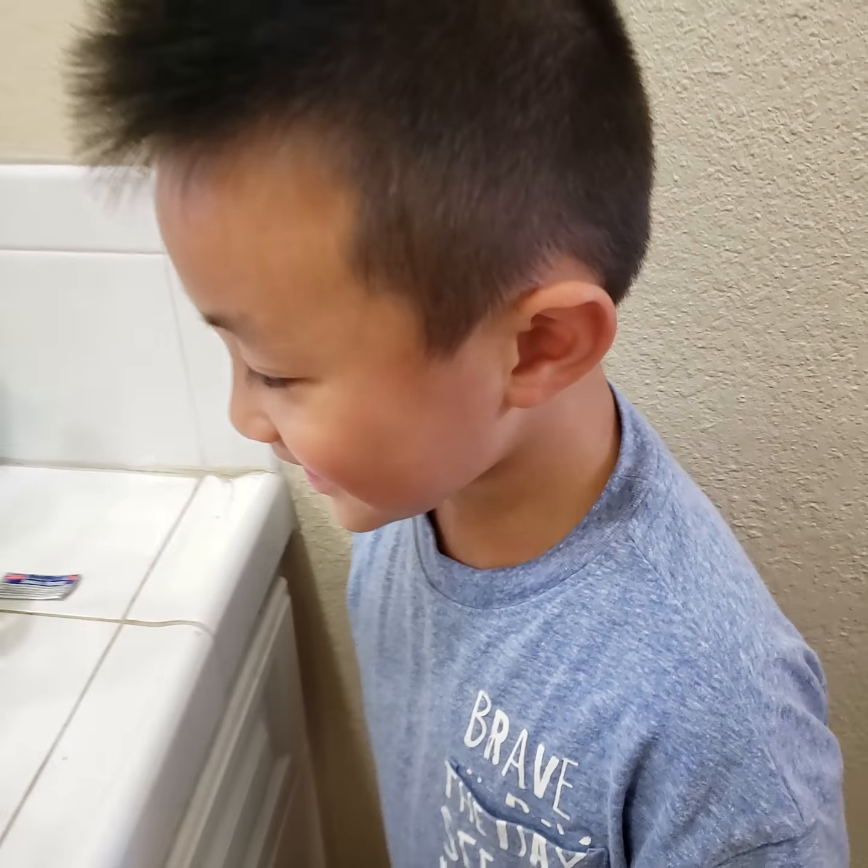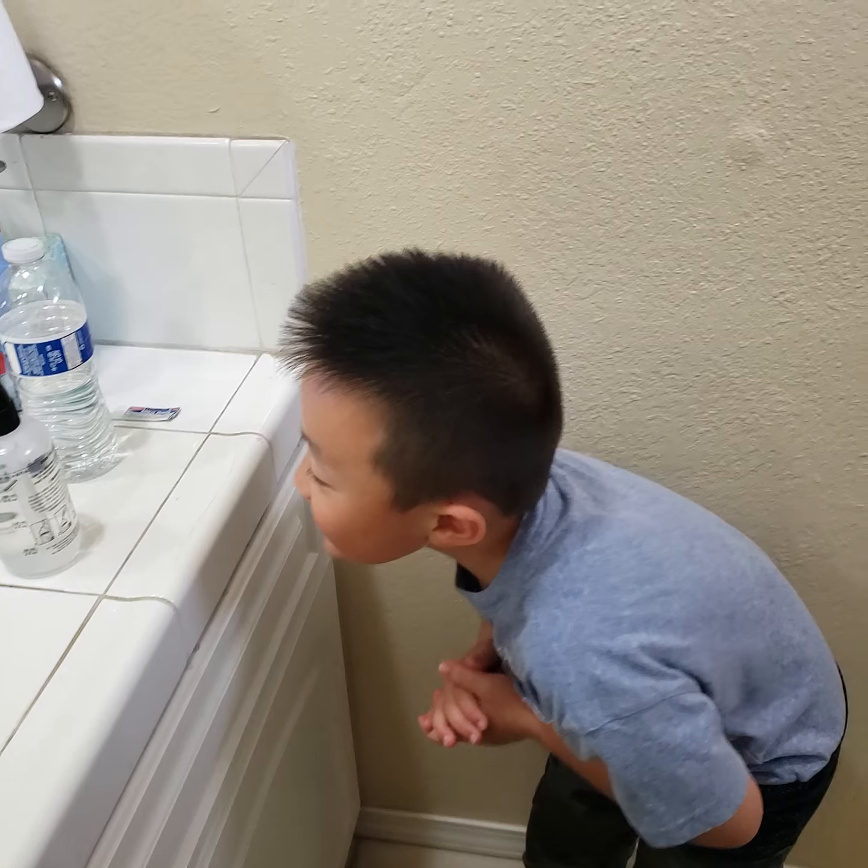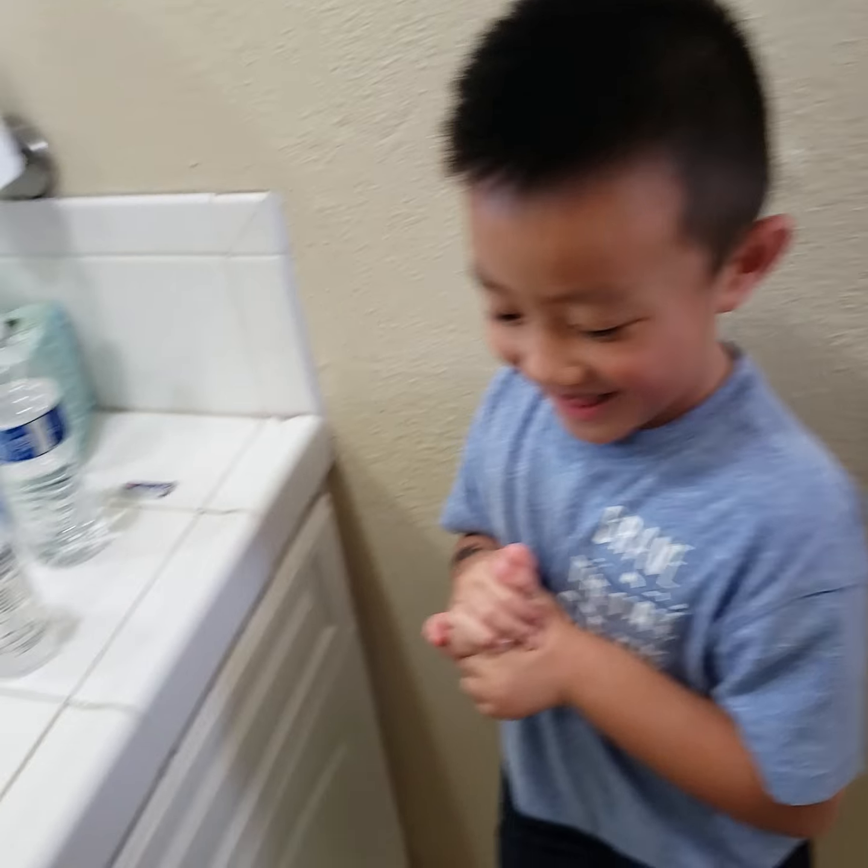You ready? He has a stuffy nose, it's his first time doing it. Are you ready? Okay. You're going to lean forward. Make sure you leave your mouth open, okay?